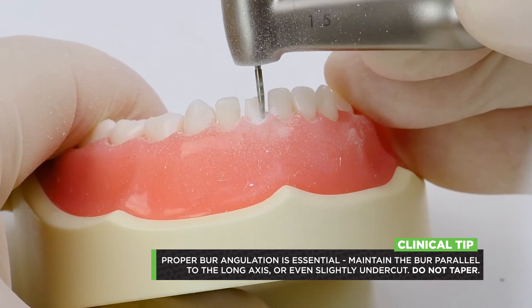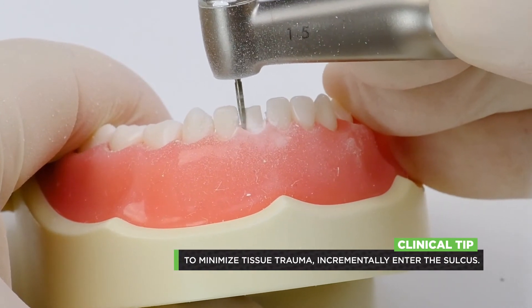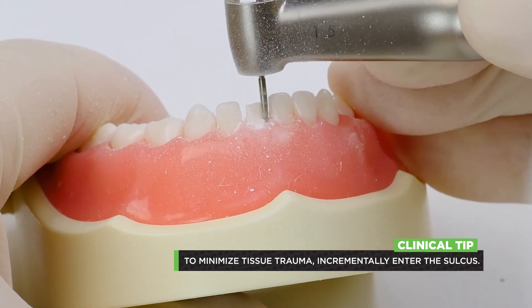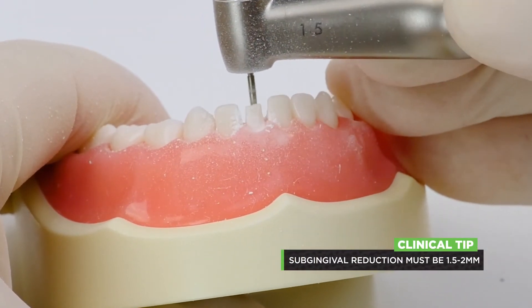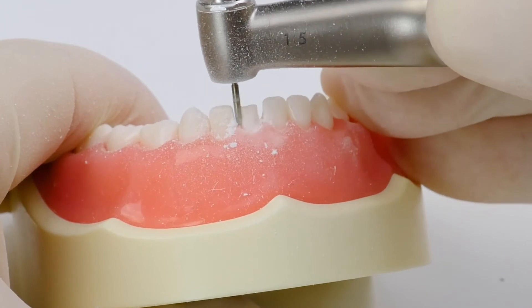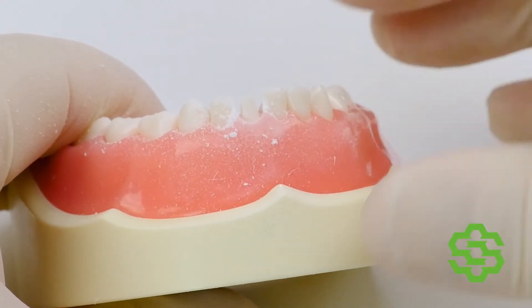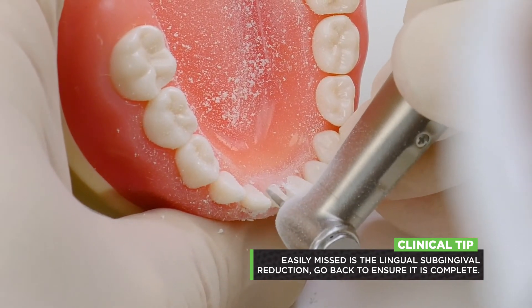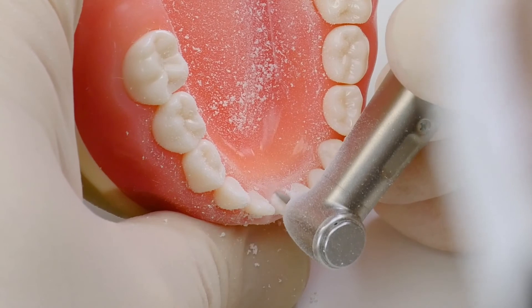Once your axial reduction starts to take shape, you're going to start to slowly and incrementally bury the tip of the burr below the tissue and do your subgingival reduction. Remember, your subgingival reduction is going to be about a millimeter and a half to two millimeters — more than what most people think they need, and that's sometimes where people get hung up. Once I do my axial reduction, I'll go back and do a little bit more on the lingual just to make sure I have enough reduction there, and I'll bury that tip subgingival again.